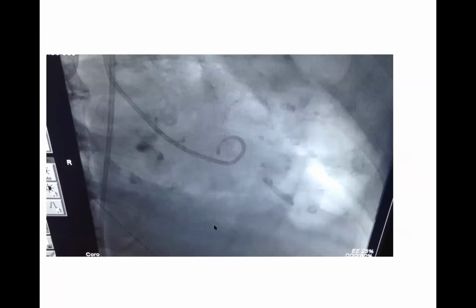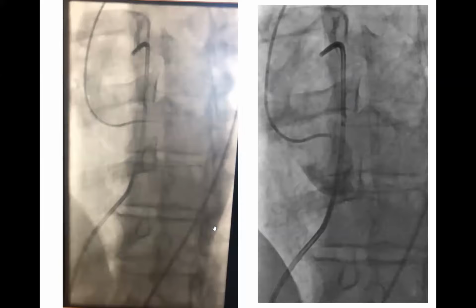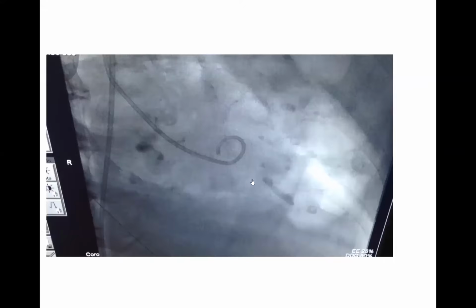Another way of measuring simultaneous LV aorta is to put one catheter, a 4 French catheter in the left ventricle and a 6 French sheath, rather than putting it in the groin, make that sheath long, 55 centimeter, and land it all the way up almost in the aortic arch. So you have almost an aortic arch, aortic pressure, and an LV pressure.